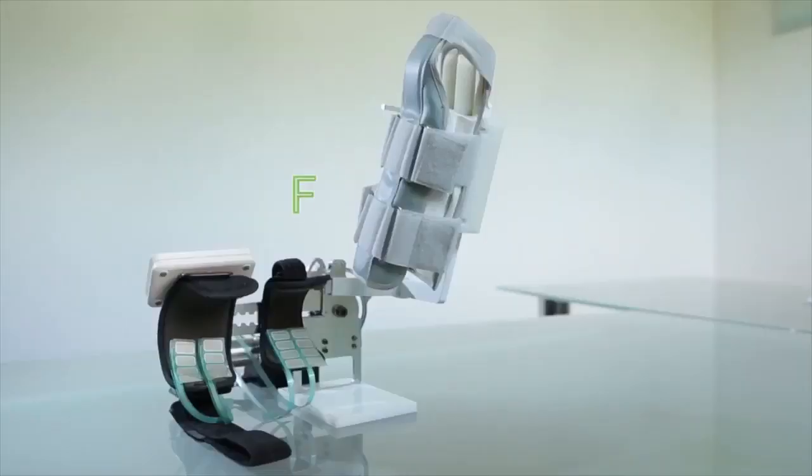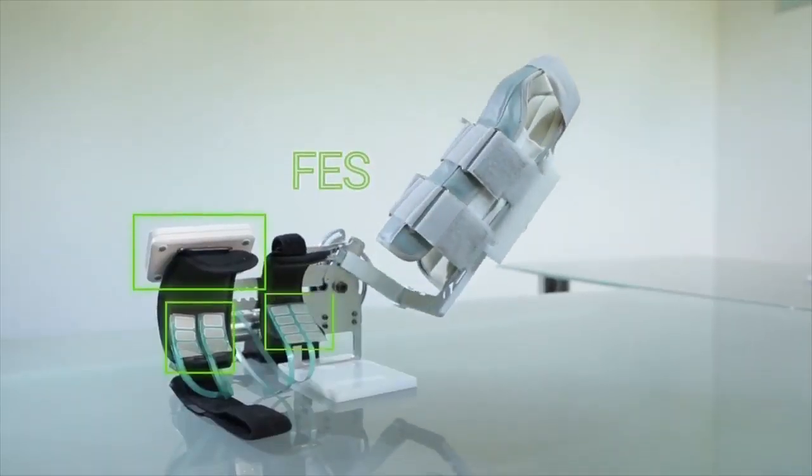RACOTO is a hybrid FES EXO device for intensive rehabilitation of contracted elbow.